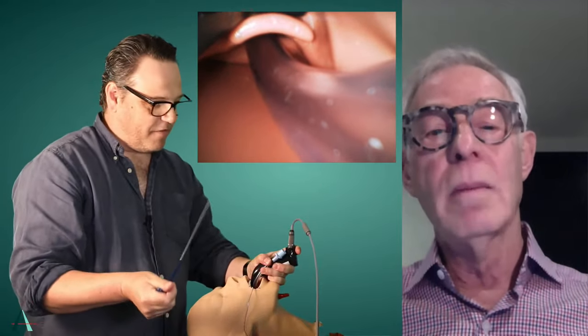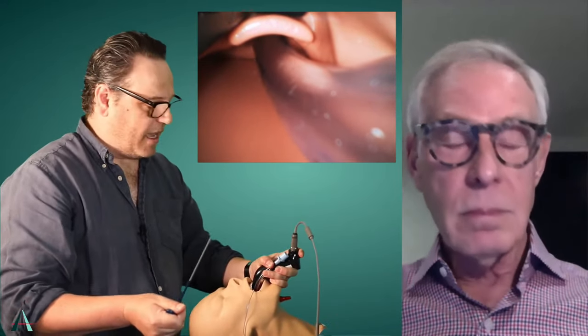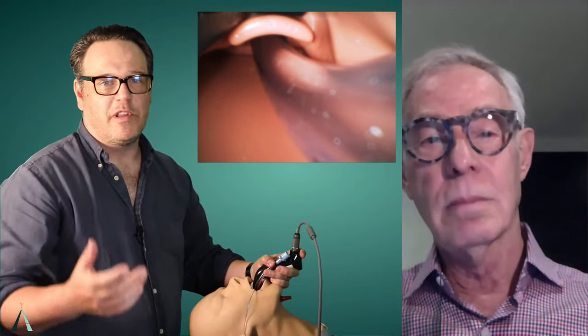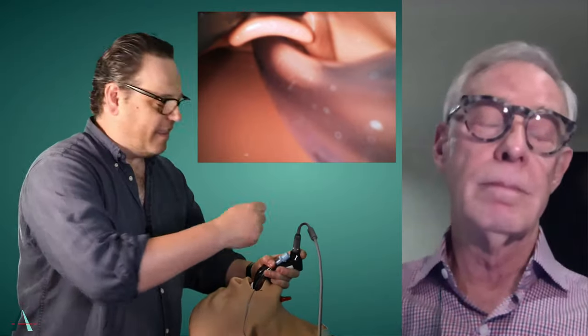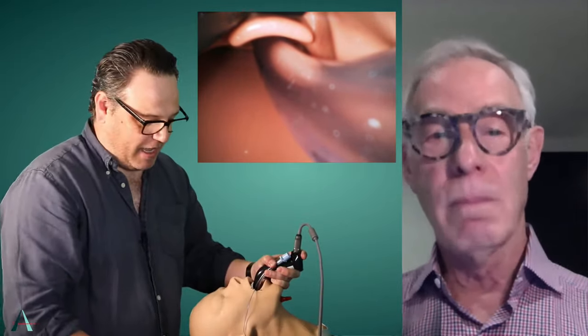Okay. Because I find if you've got a very well-trained assistant with you, as I might have in theatre, then that's fine to let someone assist you. But if I'm called to a difficult intubation on the ward, or in the emergency department where the person assisting me may be less experienced with a hyperangulated blade, I find it useful. That's quite difficult to explain in a time-critical situation what you want there.